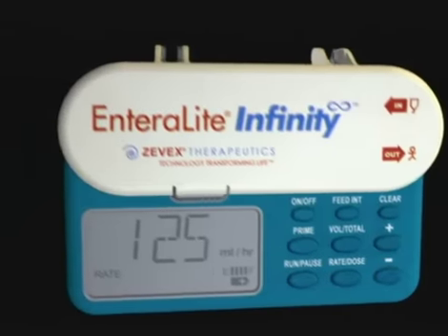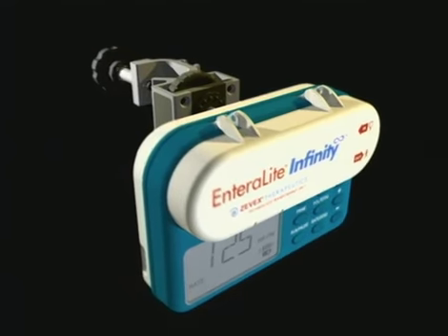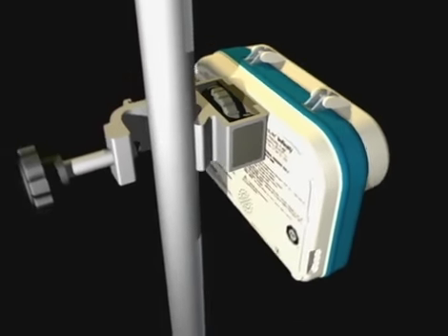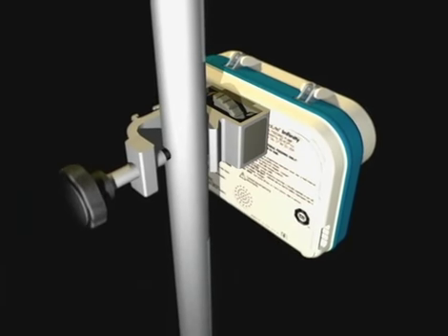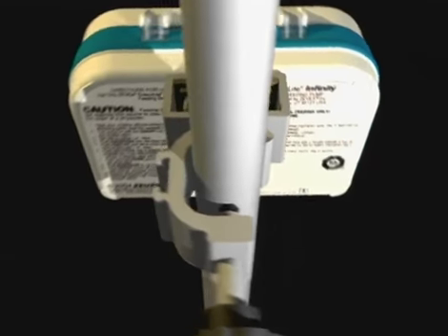Versatility is a key feature of the EnteraLite Infinity. Besides being placed in its carry pack, the Infinity can be easily mounted directly on a pole or a wheelchair. Thread the bolt into the receptacle on the back of the pump and tighten the gray wheel to secure the pump to the clamp. Tighten the black wheel of the pole clamp to mount it to a pole.